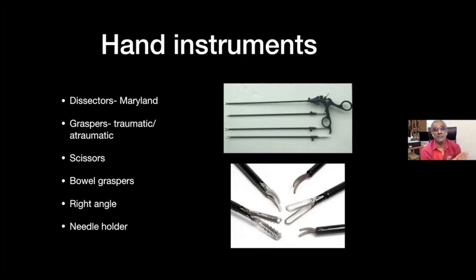And then you have to account for the fact that the patient has a very high BMI, say an obese or bariatric surgery patient, or a surgeon who is extremely obese going for general surgical work. You need to have long instruments. One size doesn't fit all. If you are going to operate on a very obese person, you need to think about this. If not, during surgery you realize that you are struggling, you don't have the instrument, then you are adjusting your port size, and then you're risking more complications.